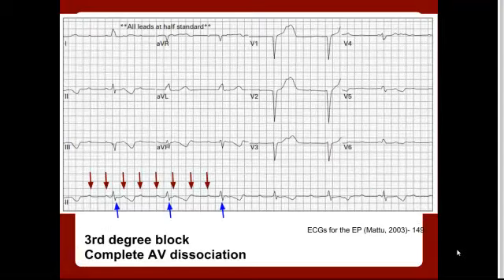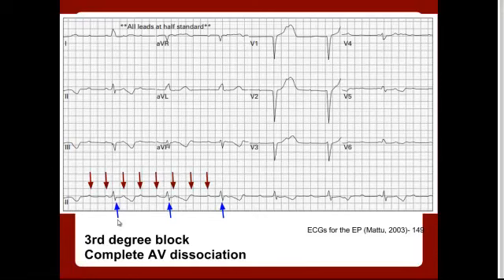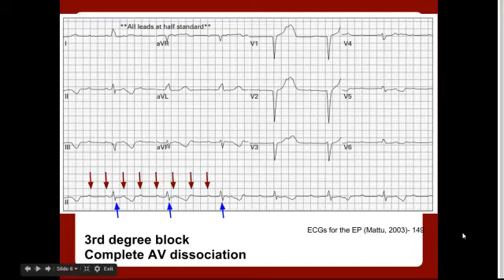In our third example — case 149 in the book — this is a third degree AV block with complete dissociation, meaning the P waves and the QRS complexes have no relation to each other. I've pointed out the P waves with red arrows along the strip. Then I marched out on the bottom line — the top tick marks are the P waves and the bottom marks are the QRS complexes. You can see they have no relation to each other, confirming a third degree block with complete AV dissociation.